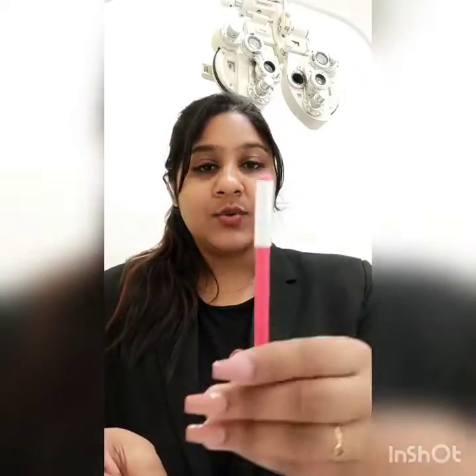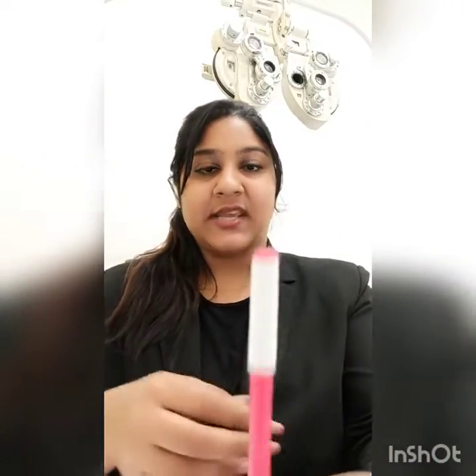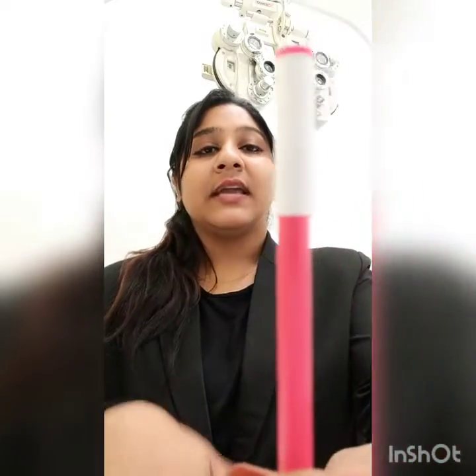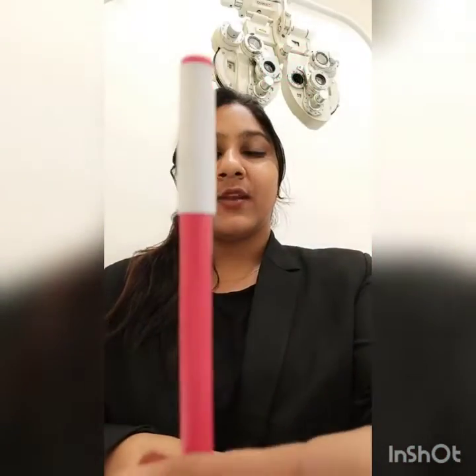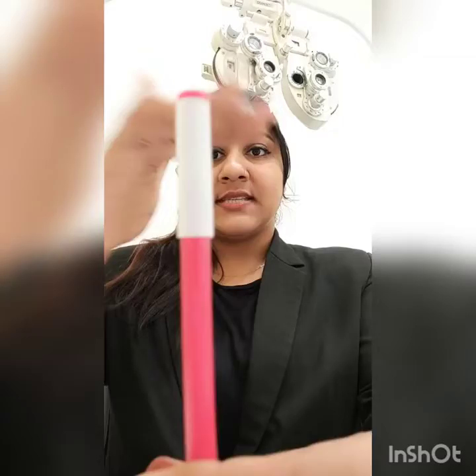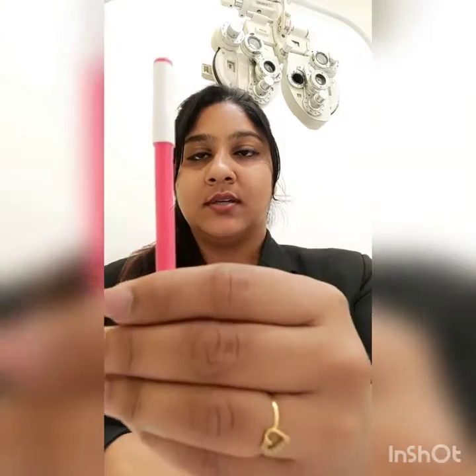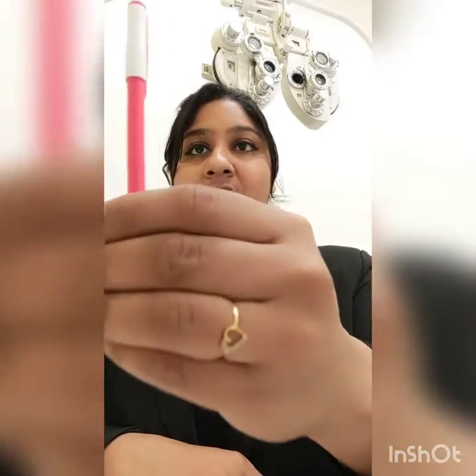Okay, so we can do this at one arm distance. One arm distance is the normal posture, and even without a pen available we can do this further, in front of our nose distance. From the nose distance, we move the pen forward and backward.